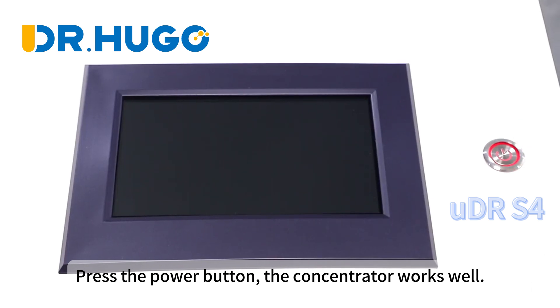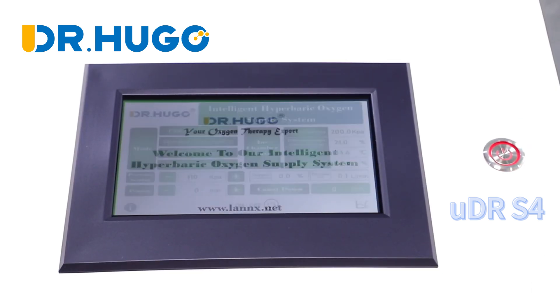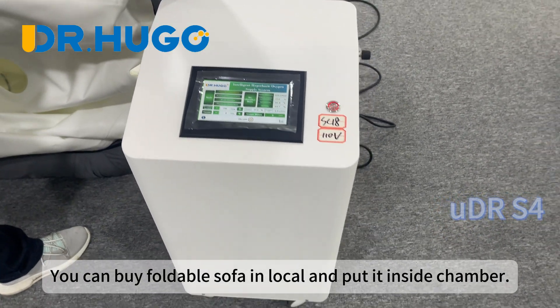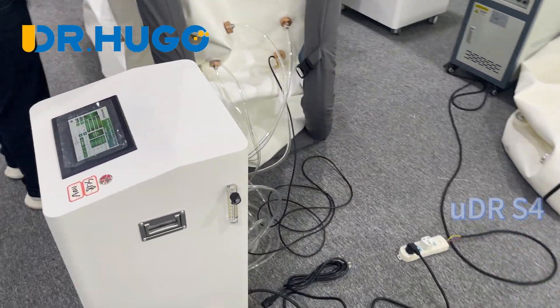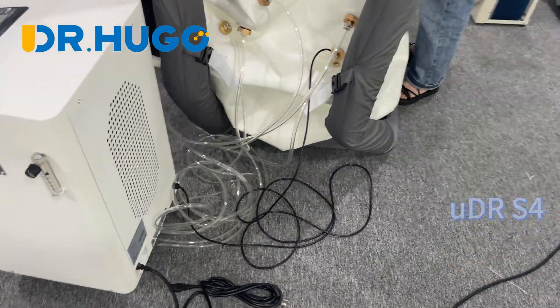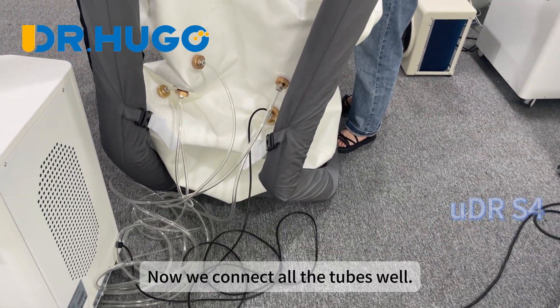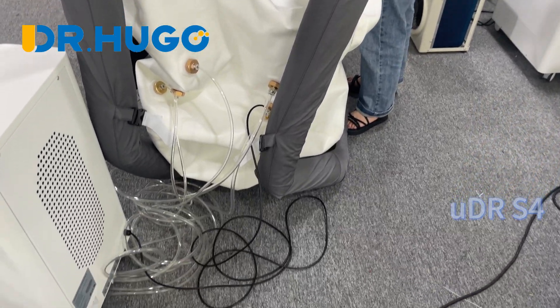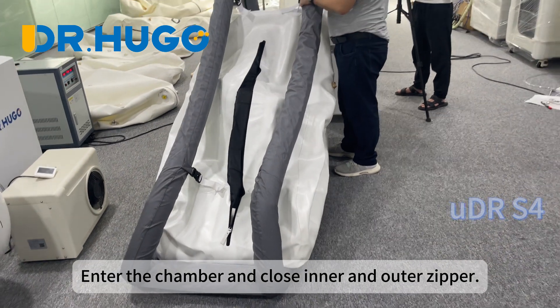Press the power button — the concentrator works well. You can buy a foldable sofa locally and put it inside the chamber. Now that we have connected all the tubes, we can start the oxygen therapy. Enter the chamber and close the inner and outer zippers.